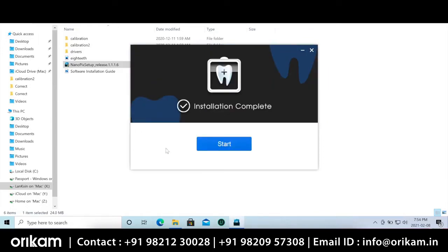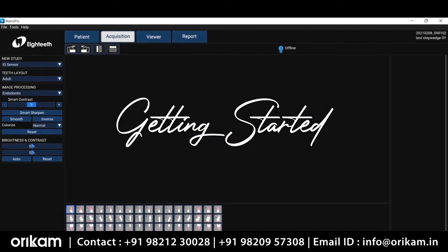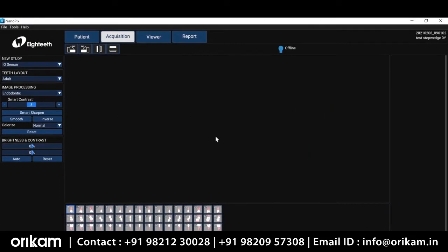All right, and now we're done. So here we are — we're into the software. You made it. It's such a great, simple, effective software to use. So let's go ahead and I want to walk you through a couple of things.